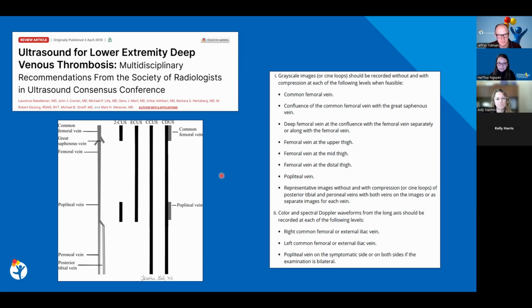No, not off the top of my head can I think of any that we have. But from the sonographer side, when we're learning about DVT and these lower extremity studies in school, they're telling us the calf is where these start. And I know that is focused mostly on the older patients, but when we're looking at patients who are a concern for DVT due to a long car ride, long plane ride, those kinds of things, I do think it's really important to look in the calf because we might miss something.